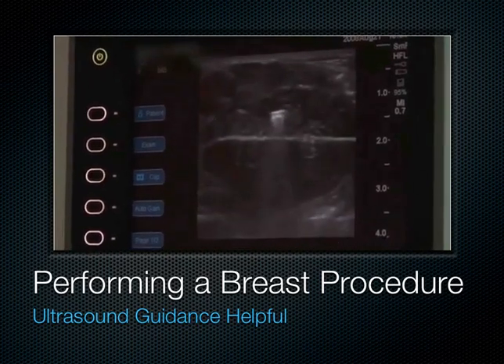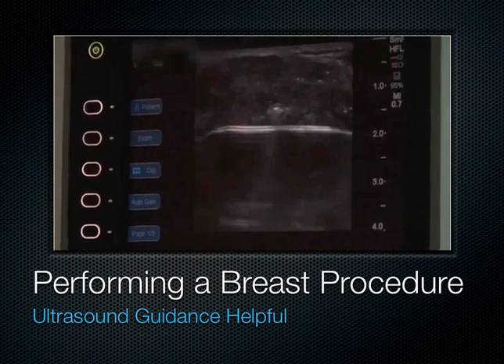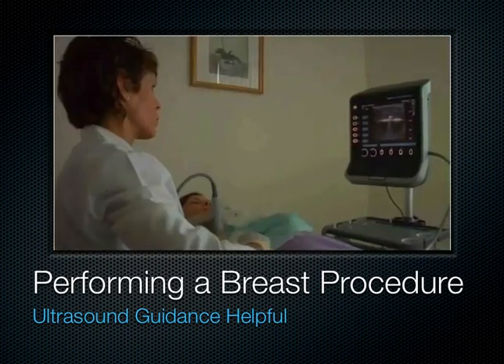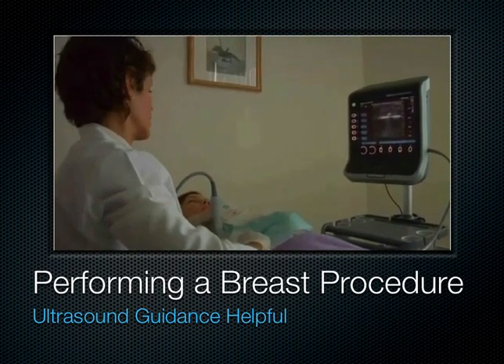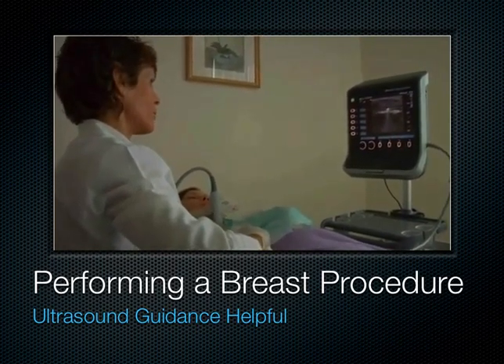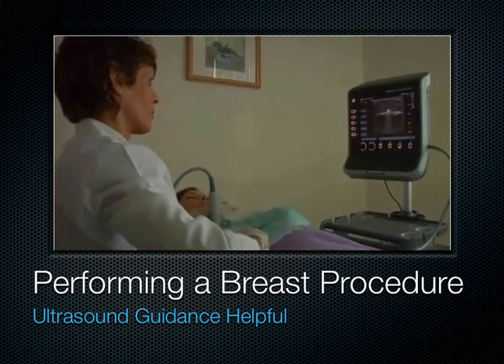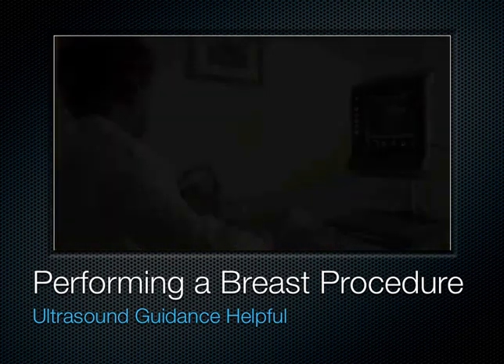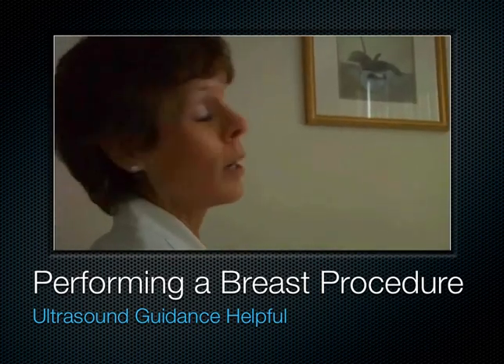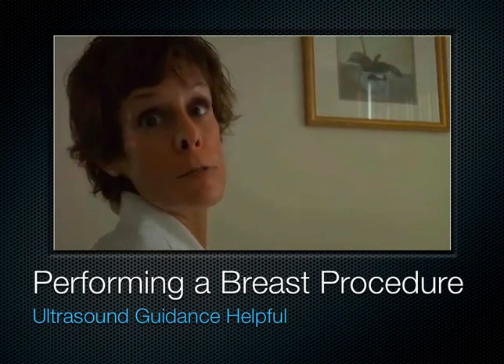So what you'll see if you're watching on the screen, you see the probe there, and you see it starting to get black behind it. That's because the ultrasound waves can't go through the ice. You'll see that double white line get higher and higher and higher, and that's just as it's starting to engulf the whole thing. It sort of eclipses it. As you can see, you have to have the probe centered directly in the middle of the lesion. This is not something you can just do by palpation or just by feel.